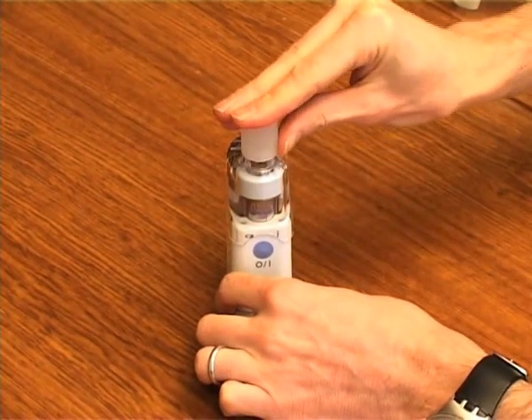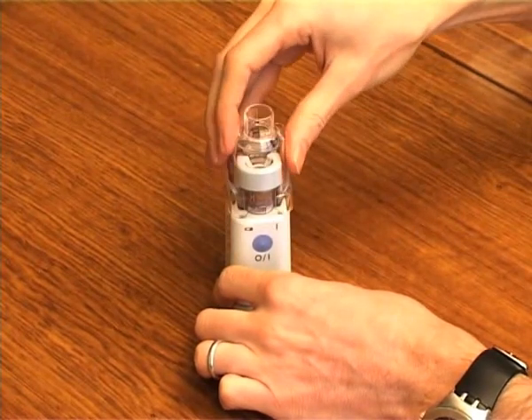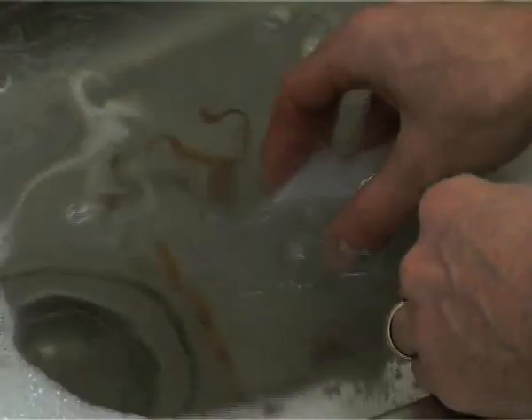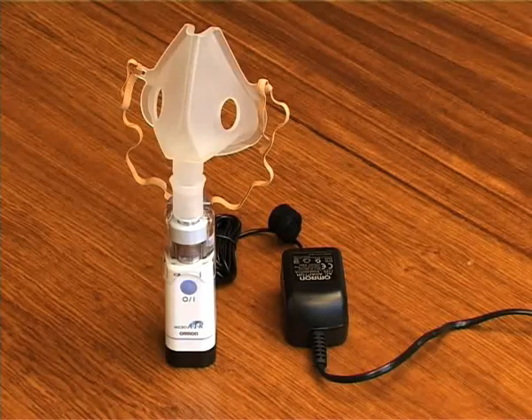Remove the parts from the main unit and discard the remaining medication. Wash the parts in water and dry the parts thoroughly. Reassemble the unit and store it in a clean, dry place.